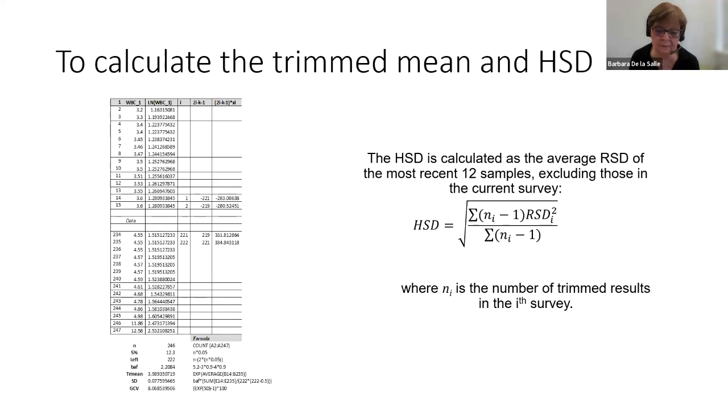You can probably calculate it from some of the data that is produced in the report. However, you will probably not get quite the same answer, and that is one of the biggest problems we have. Often participants come back to us and say, I've calculated this, I don't get the same answer as you do. As long as it is close enough, I'm generally fairly happy. If it's way out, I might go back and look at our data. But you need to remember we calculate to far more decimal places than you may expect, or than we show in the reports. And it is quite a complex and statistically validated process.